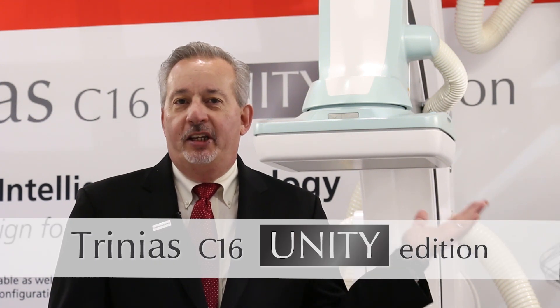Welcome to RSNA 2019. This year at RSNA we're featuring the Trinias Unity C16.